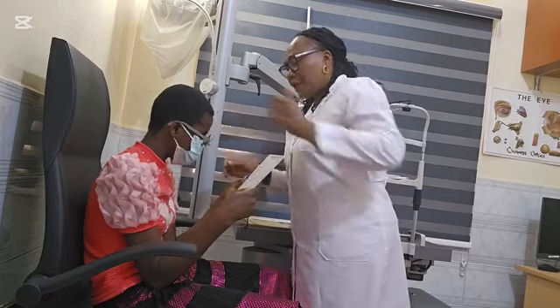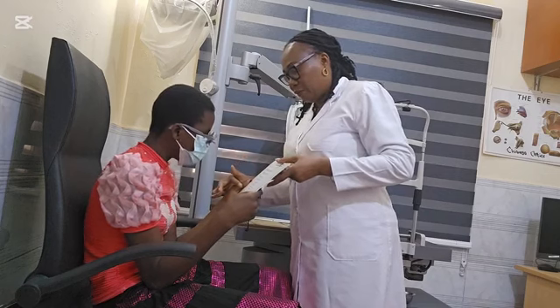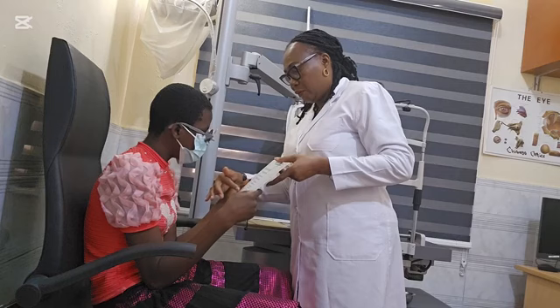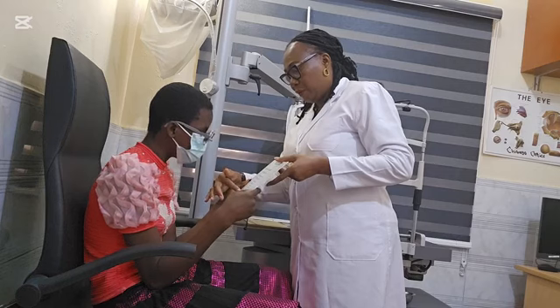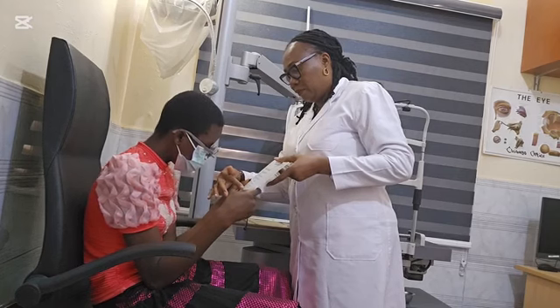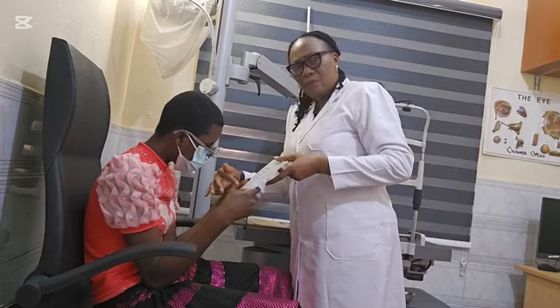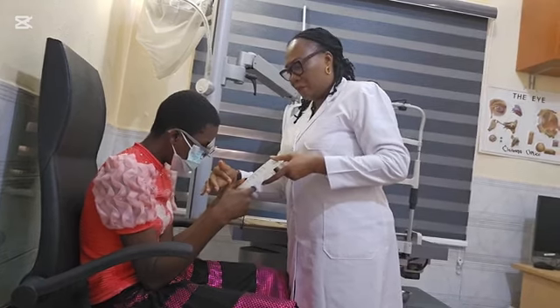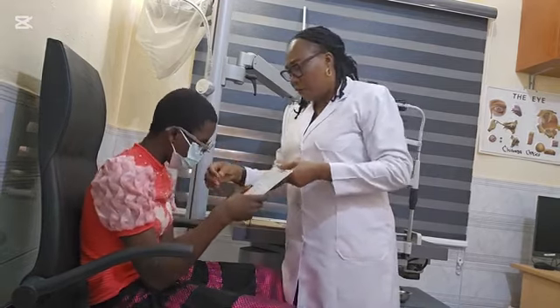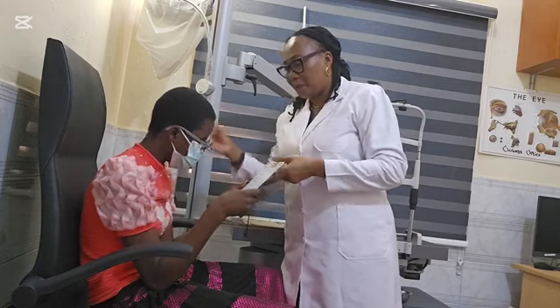And let's go to the left eye. Read again, let's see. The Lord puts the gifts in a long green bus. Okay. Two of the boys slept under the lake. So for the left side, you could also read 1.6 M at 25 cm.